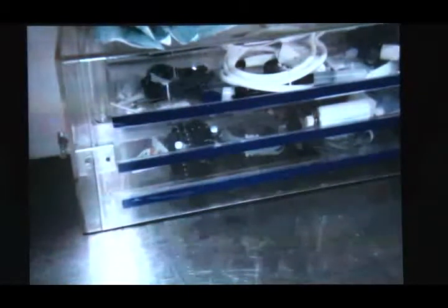Especially for our vitrectomy cutters and things, it should not be used, because there is no validation for this. You don't know whether what is kept there is sterile or not. But as such, actually it's a very good sterilizing agent, but there is no validation.